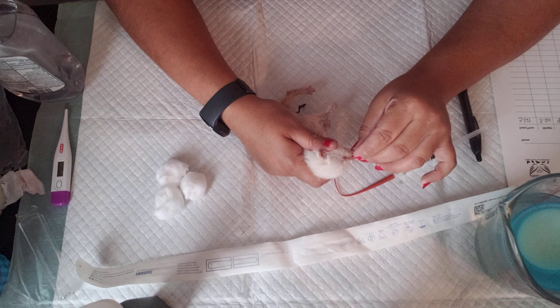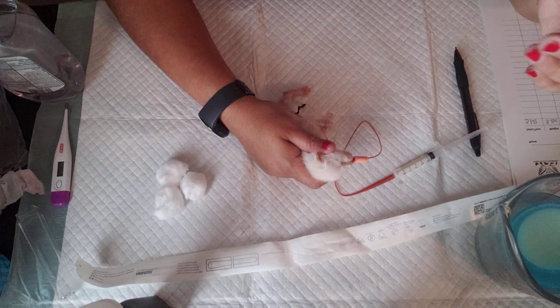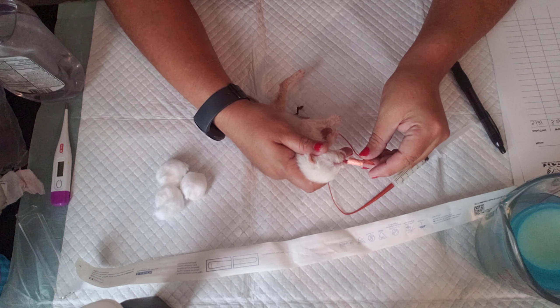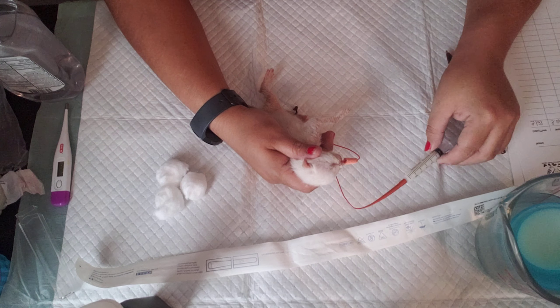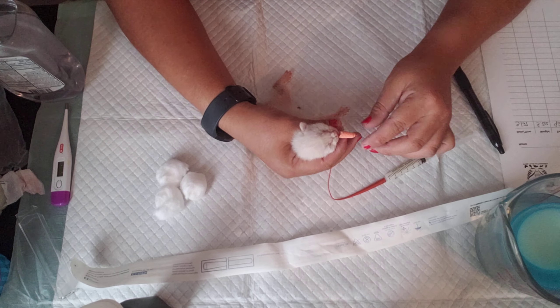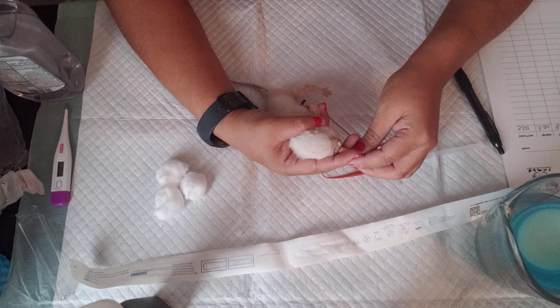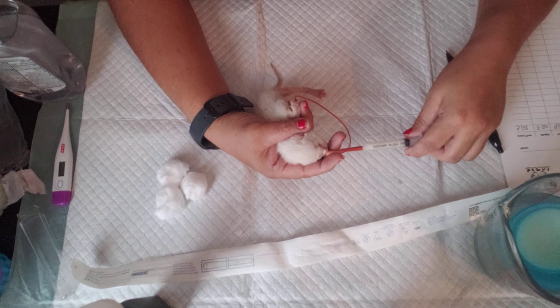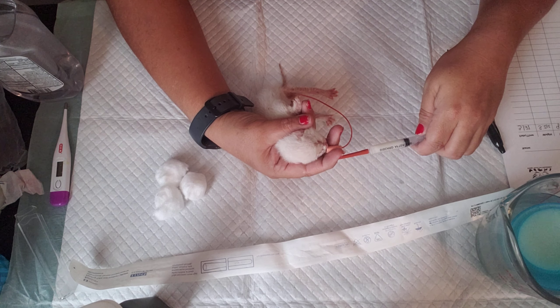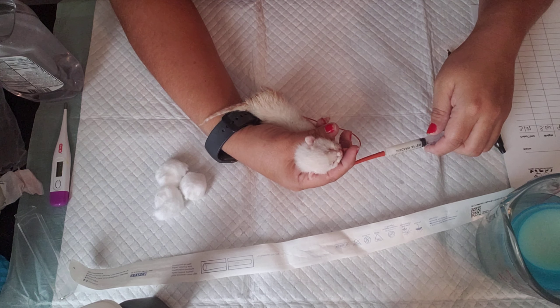Just take your time. If you hit the wrong place, they'll let you know. There it is to the kitten's lip. Now just hold on, darling. You just want to push a little bit and make sure none comes out of the nose.